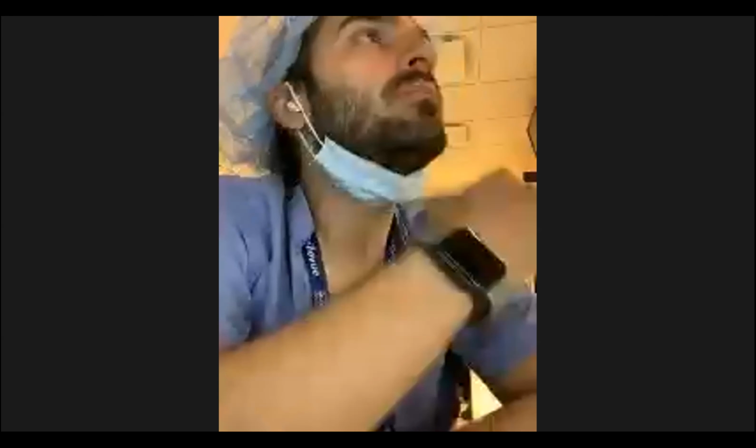I personally find that in this type of situation you have to distinguish between a petroclival meningioma supplied by the MHT, where you just get a little bit of catheter in the origin, you can safely inject particles without refluxing into the carotid, because you're not putting pressure on it that is going to reflux, and you can see it.